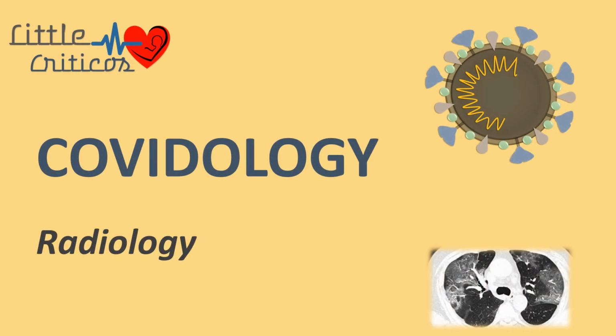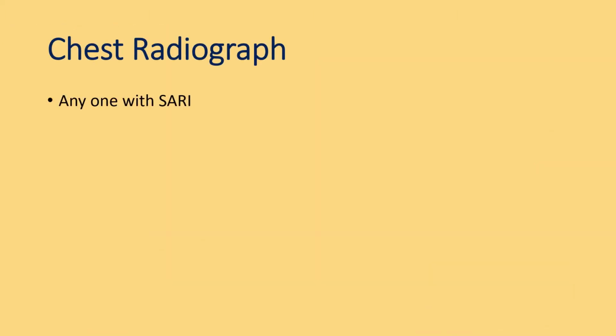In this video, we will discuss the radiological perspectives of SARS-CoV-2 infection. Chest radiographs are one of the most common investigations performed in SARS-CoV-2 infection. Any patient with severe acute respiratory illness will need a chest X-ray.